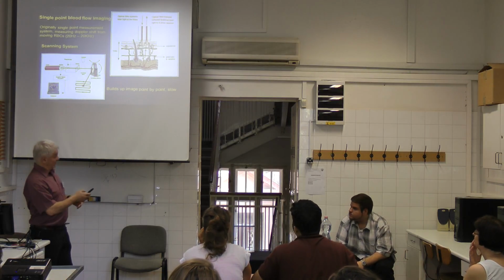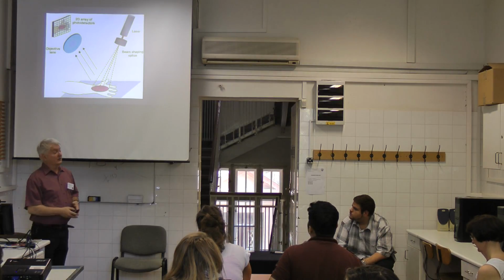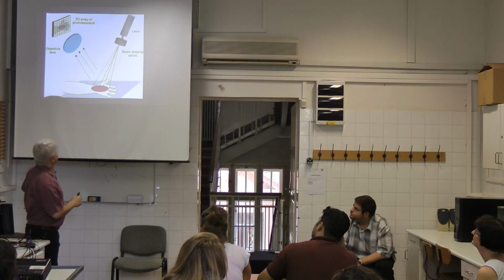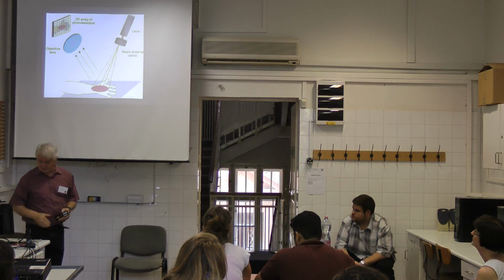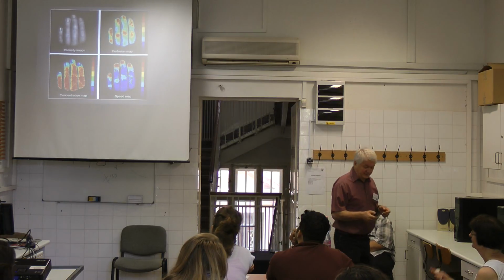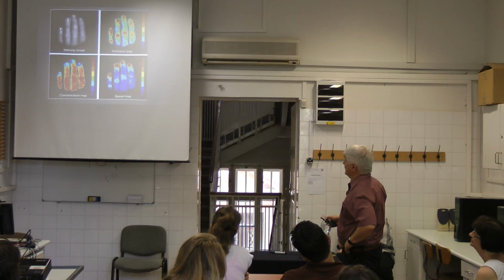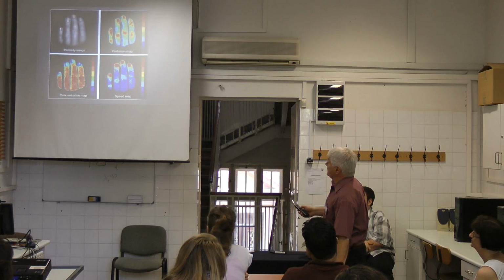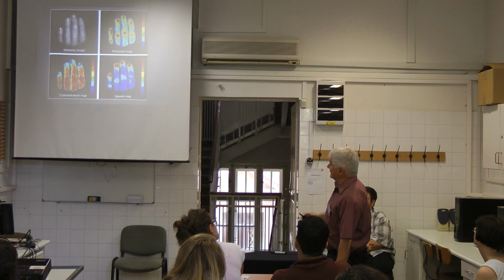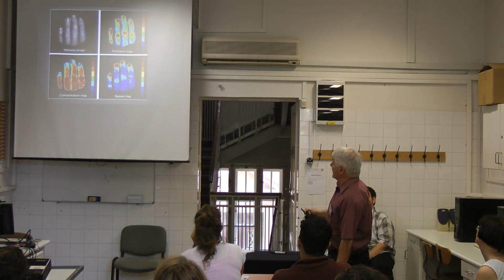So again, these measurements were made mainly by single point measurements. And now I'd like to talk a little bit about open field measurements, when the laser light is dispersed and we get back a scattered image. So these are skin microcirculation images. This is the intensity, this is the perfusion, this is speed and concentration. So what can we deliver from this one? On one hand, the speed map, how quickly the blood is flowing, how much blood is concentrated, and also the dynamics of the perfusion.